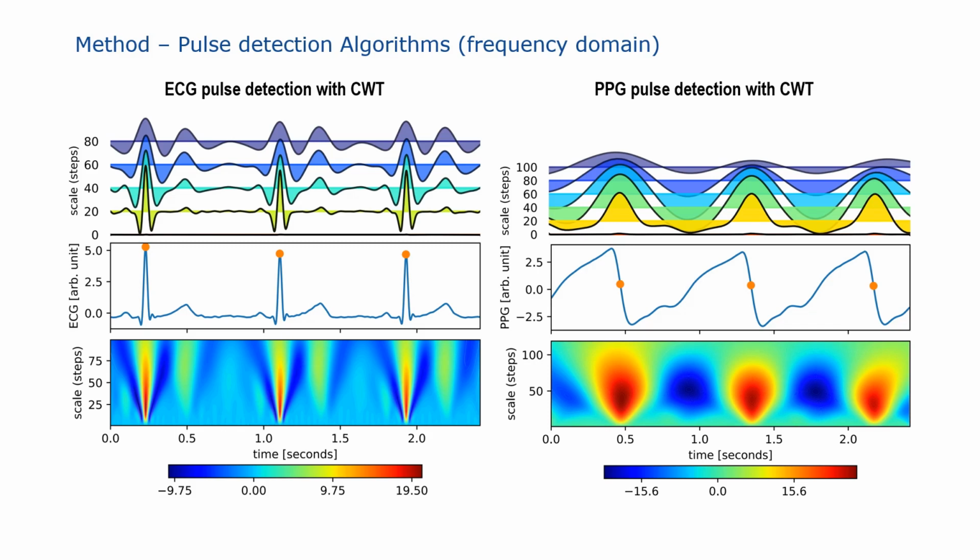It can be seen that the result of all the convolutions form a kind of mountain ridge. The ridge line represents the location of a pulse. Therefore, the algorithm tries to locate ridge lines in order to detect the cardiac pulses within ECG and PPG signals.